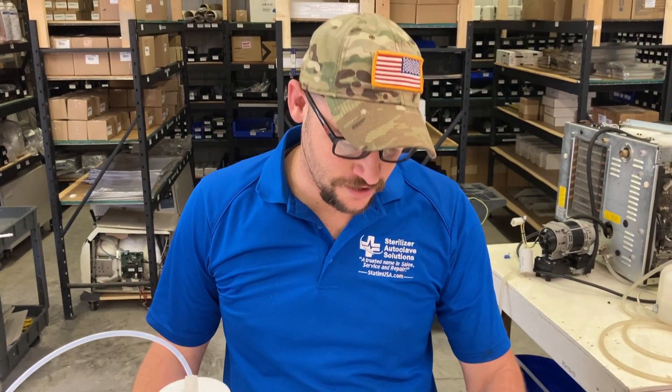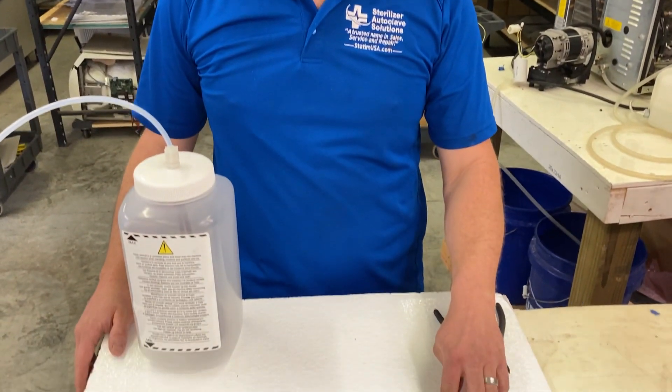Hey, this is Stanley with Sterilizer Autoclave Solutions. Today I'm going to show you how to change the wastewater fitting on Cycan products.